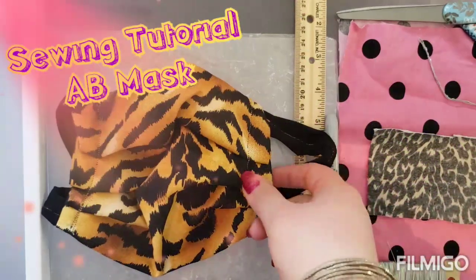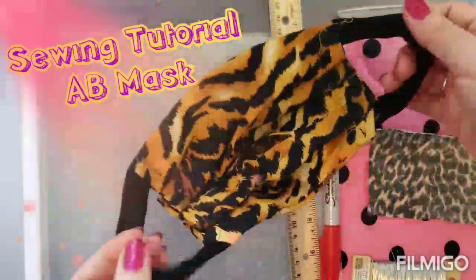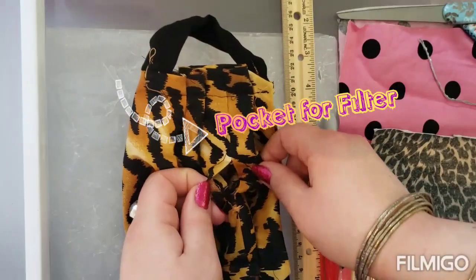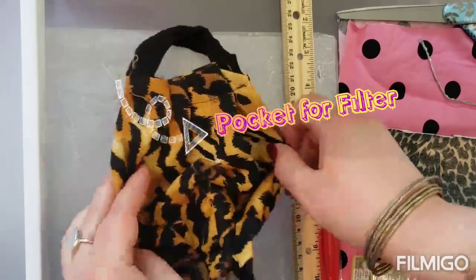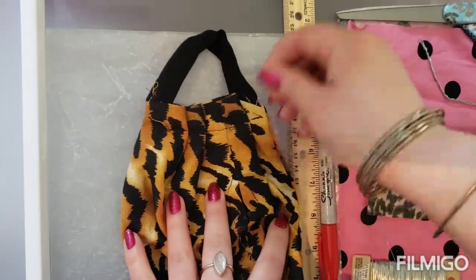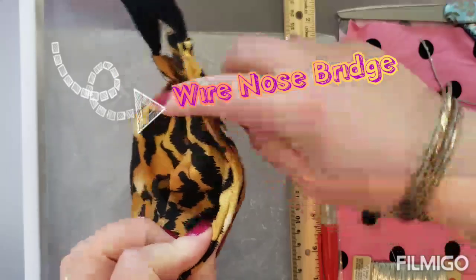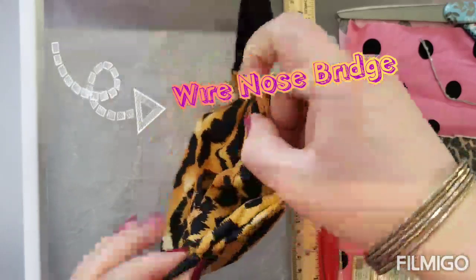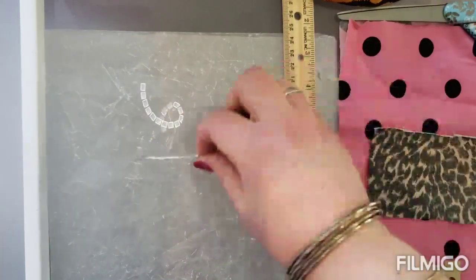We're going to be making an AB mask. It has ear straps, a pocket so that nurses can put whatever filter they want in it and then reuse it over and over again. It also has a wire in it so you can pinch it and it will hold its shape.